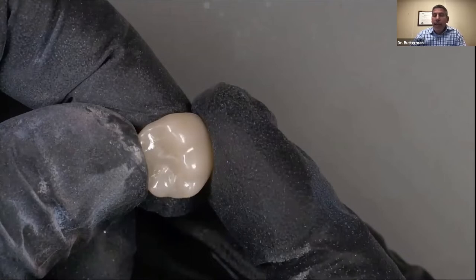And if you're going to do it, I would encourage you to maybe try doing that at the green state, because you can do the exact same thing. You can use the exact same instruments after it comes out of the oven, once it's already sintered. But think about it, the material is hard. So you're going to be working harder, you're going to be pressing harder. And the risk of pushing too hard and creating too much heat when you're polishing is you tend to create more of that weird kind of opalescent look that a lot of zirconias can get from over polishing. So I feel like we're going to reduce that risk quite a bit in the pre-polish.